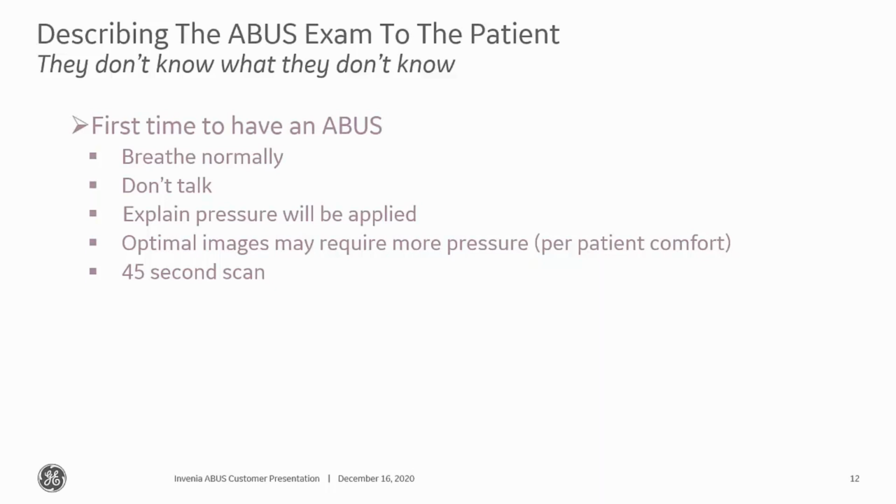And just explain that pressure is applied, and we just want you to hold still and don't talk during the acquisition. And you'll feel that transducer move across the breast, starting in the middle, going towards your feet, and then towards your head. So just a kind of a simple talk track.